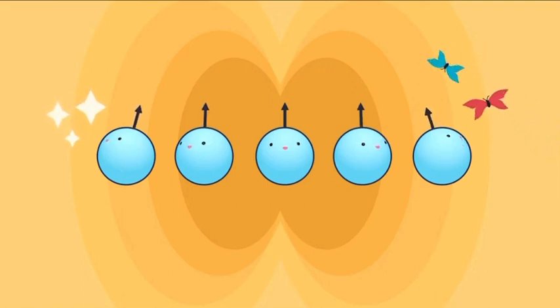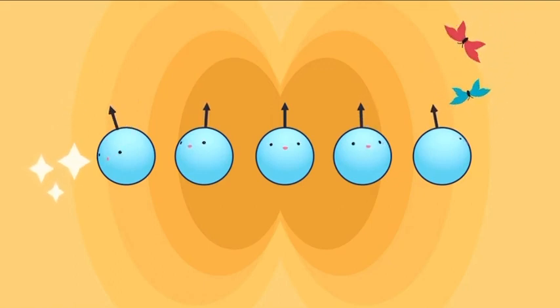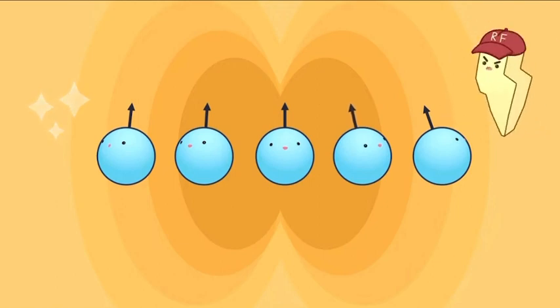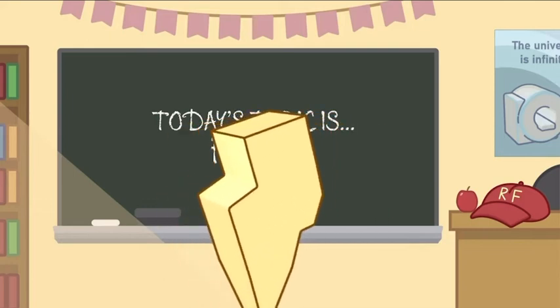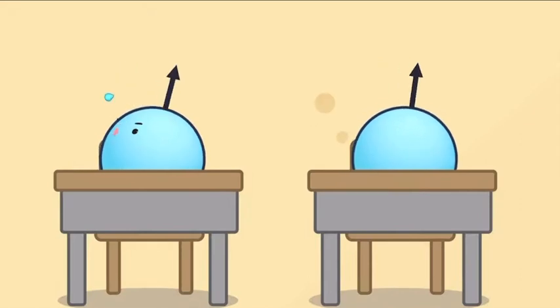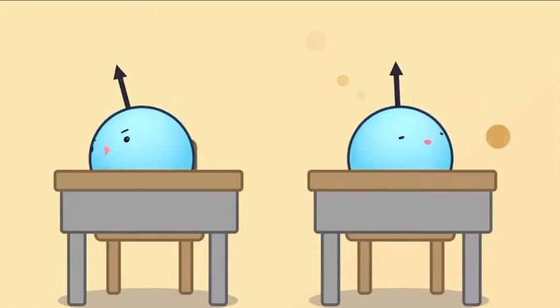T2 star effects seem terrible. Isn't there any way to fight them? Fret not. The answer is yes. The good news is that we can combat T2 star effects and their resulting signal decay with the addition of another RF pulse. To understand this, we must remember that although magnetic field inhomogeneity is inconvenient, it is manageable in the sense that the differences in precession speed that they cause are fixed and predictable.